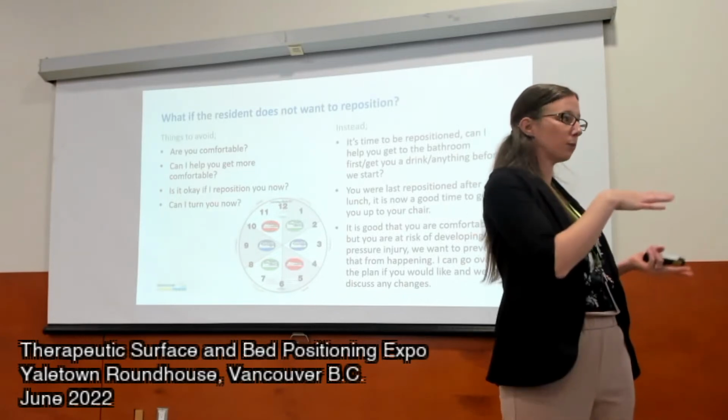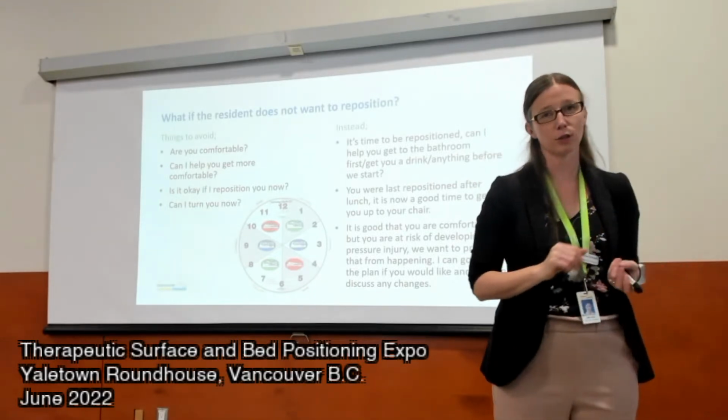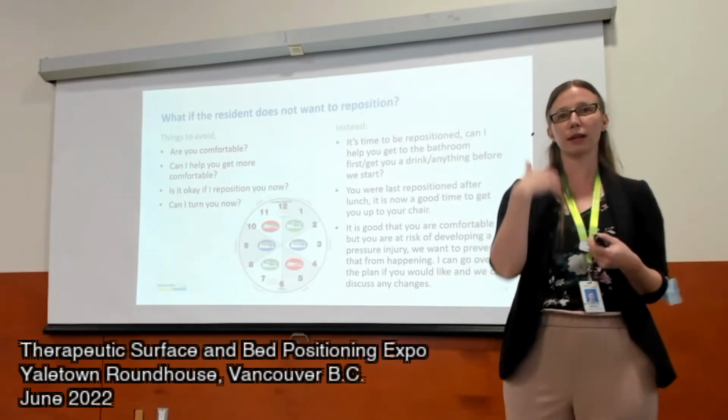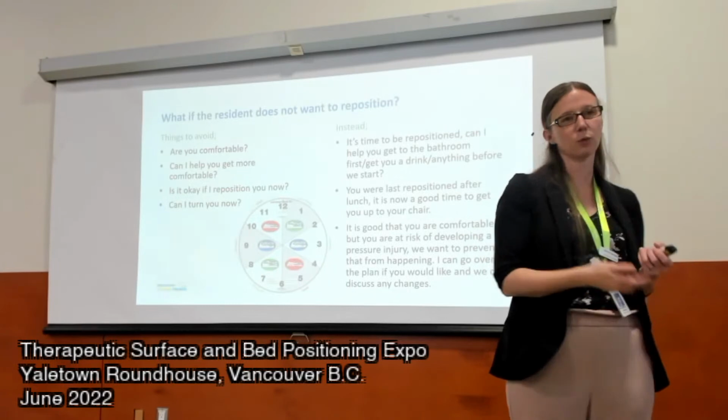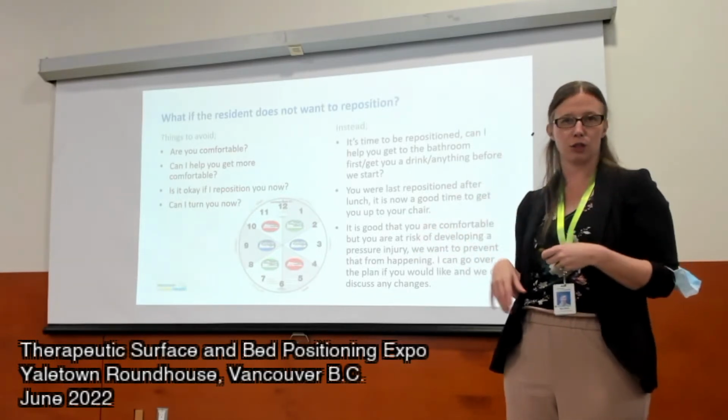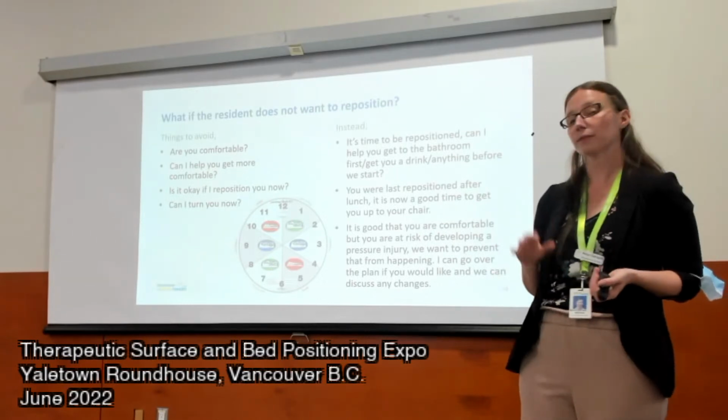So I'm not going to reposition so I'm looking at the wall for the next 2 hours, because then no, I don't want to be repositioned. But maybe move the bed so I can still watch the TV or visit with my friend. Look at what they need to do and work that into your repositioning schedule.